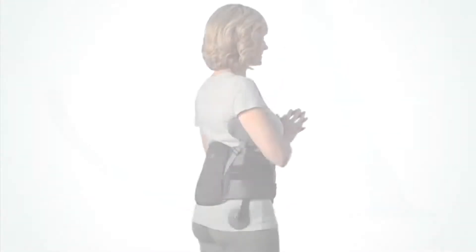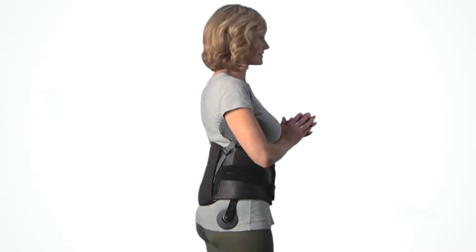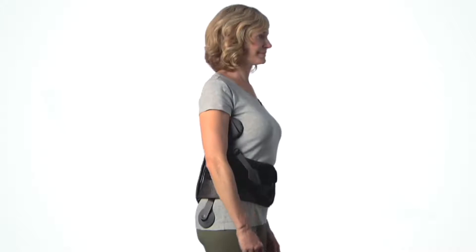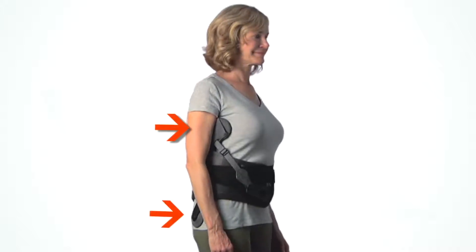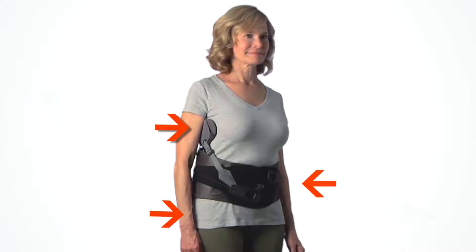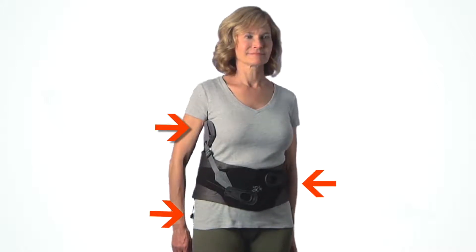The Peak Scoliosis Bracing System acts as an unloader brace for the spine. In this configuration, the force is applied to the patient by the thoracic and trochanter pads on one side and the belt with or without the lateral pad on the other side.